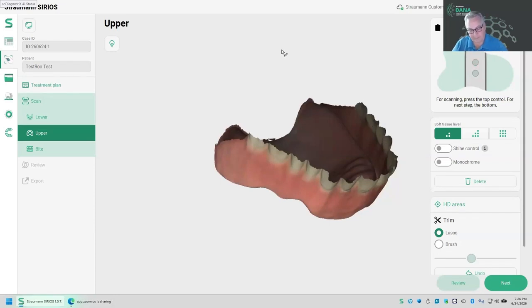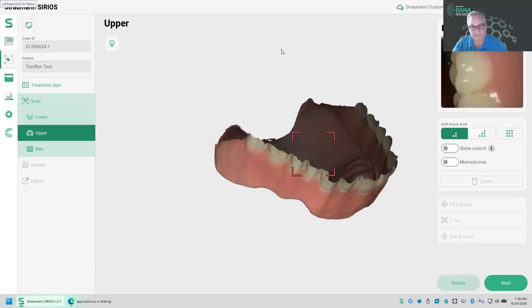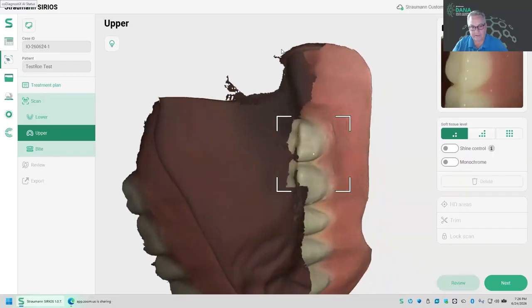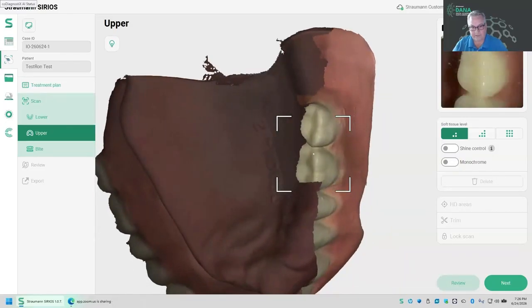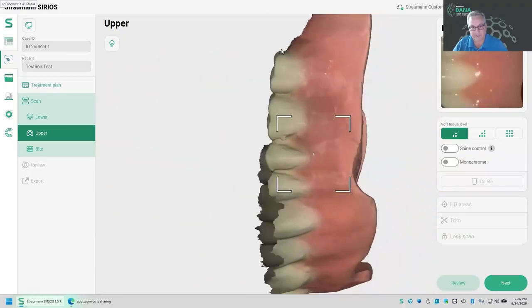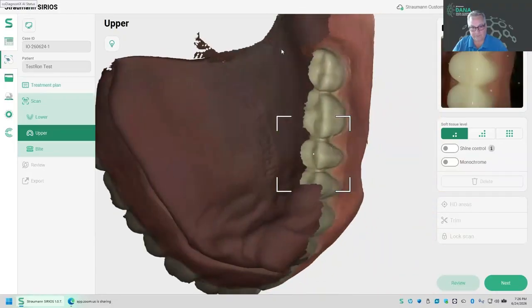So I come back into my denture, starting with the facial surface here. It recognizes it right away. I turn and capture the occlusal. And now we'll just come around the denture from the facial and build to the occlusal.